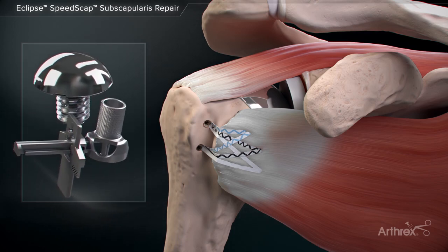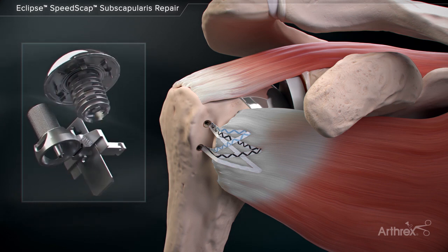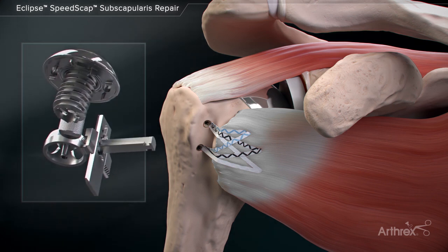Eclipse speed scap repair is a knotless double row method used in conjunction with the subscapularis peel for anatomic total shoulder arthroplasty.